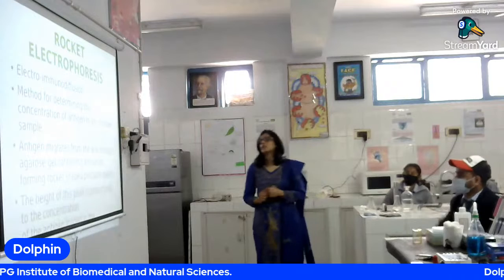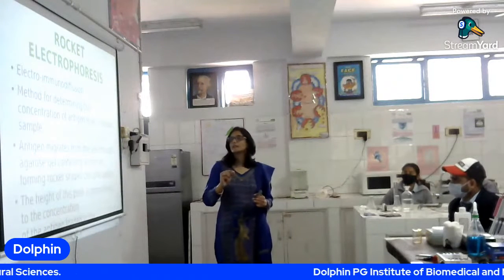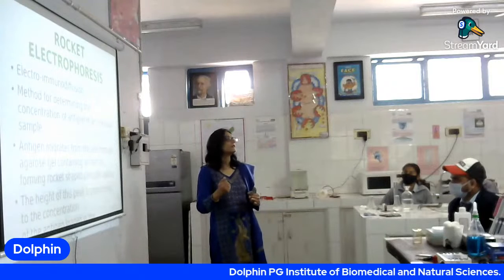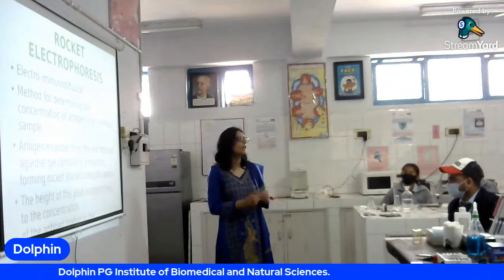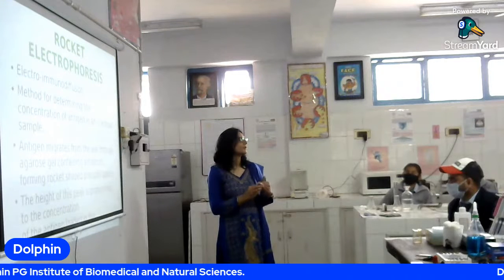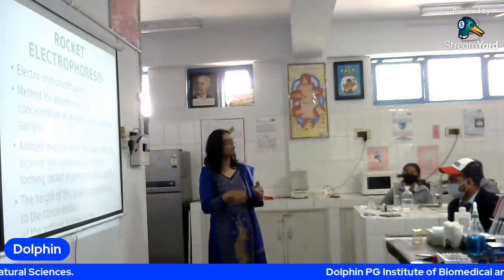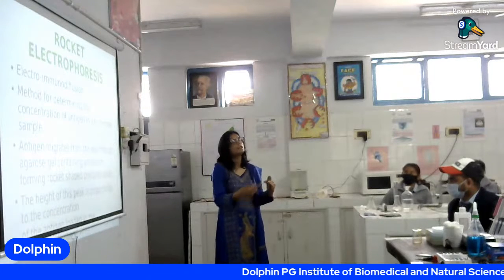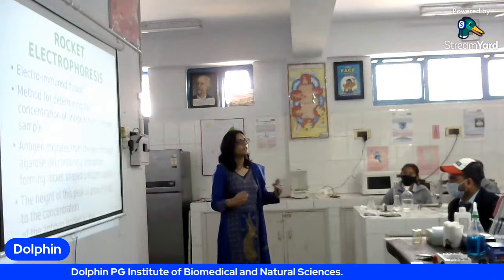Okay. So हमने अब देखना है band बन जाएगा, और band जो बनेगा, you will see that band is in the shape of the rocket. तो उस रॉकेट की जो है हाइट हम निकाल देंगे. As you have to measure the diameter, I think. So next जब रिजल्ट आएगा, so you will measure the height of that rocket. और कितनी हाइट है?